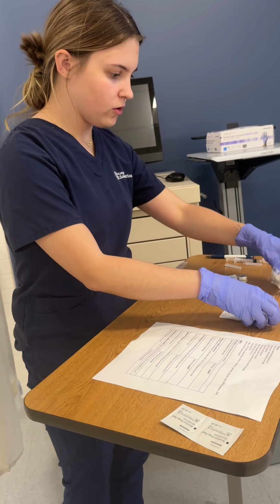So now we are gonna create our labels so we don't get this mixed up. So it's for Sam Johnson. It is Fluzone, 0.5 milliliter for an IM injection. And then we're gonna put that on here.